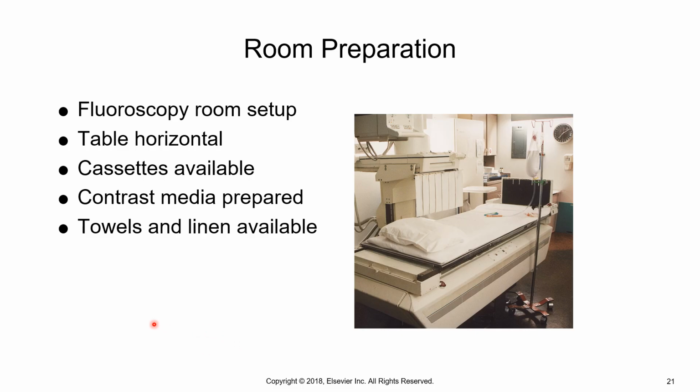You should always have towels and linens, anything that you might need to clean the room, because occasionally patients do push the tip out and then you have sometimes a lot of barium leaking out, and then usually when it leaks, it's going to spill over onto the floor. So towels, linen, pillowcase, anything you might need or deem necessary for the procedure.